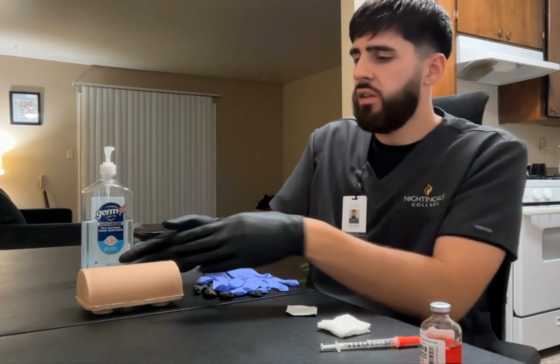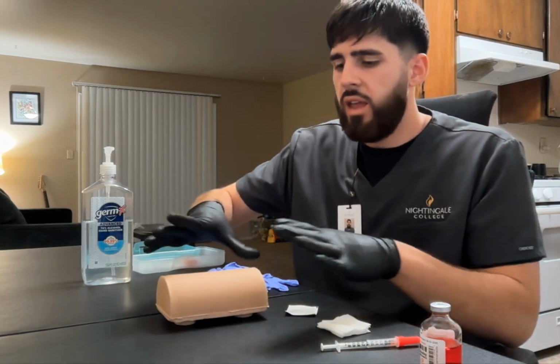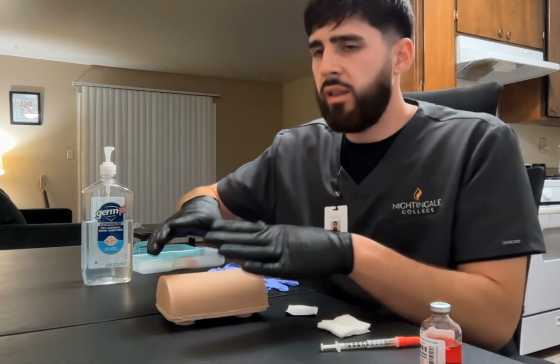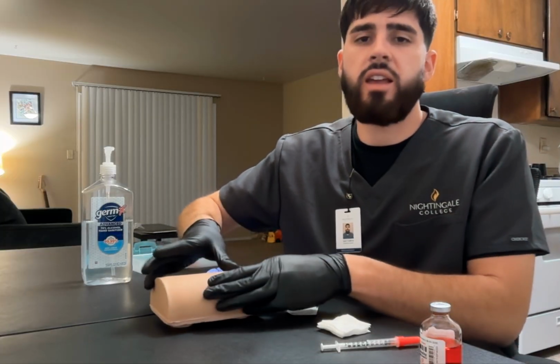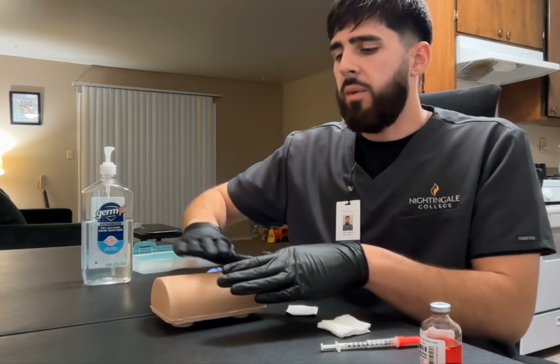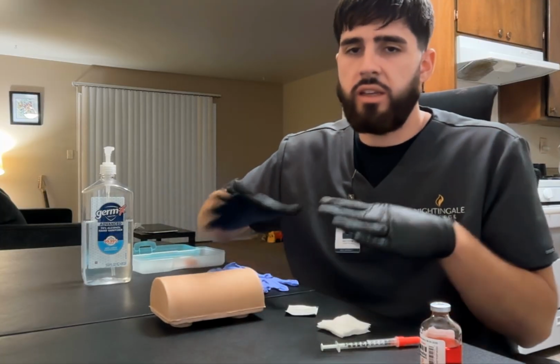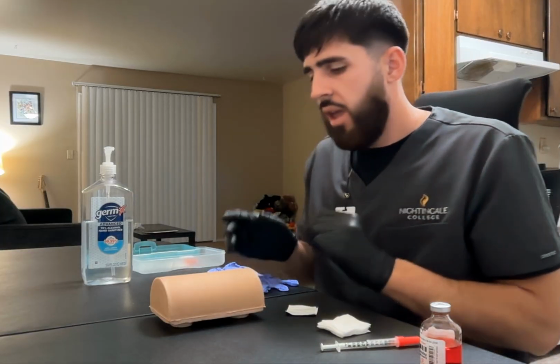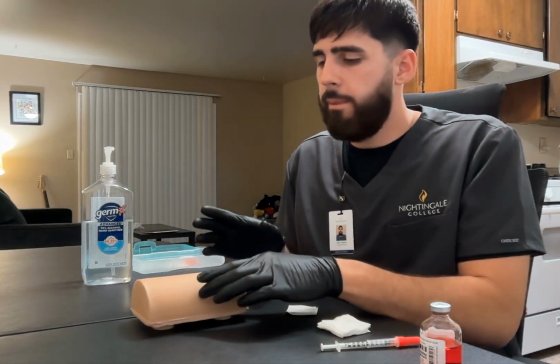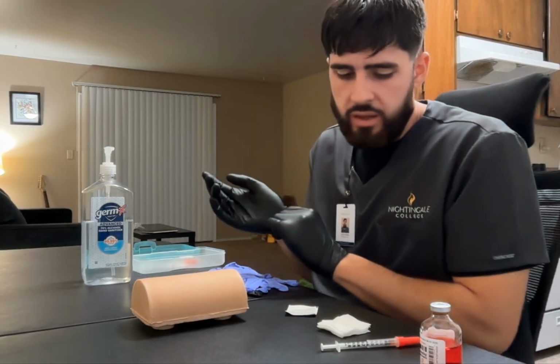Now I'm going to go to my patient. I'm going to inspect the site. I'm going to check for any swelling, any rashes, or anything that would signal to me that an injection in that site is not appropriate. I'm also going to palpate the area and make sure that the injection site is viable for receiving the medication. I have now verified that that is a good site to do, so I'm going to remove my gloves and throw these away.